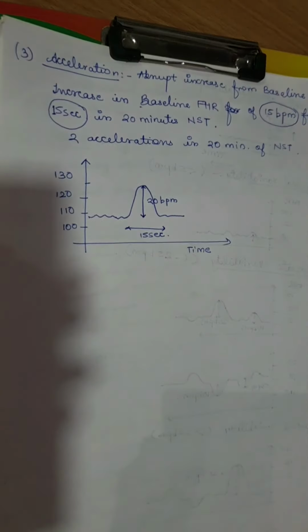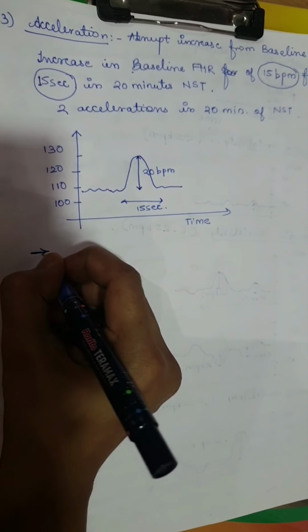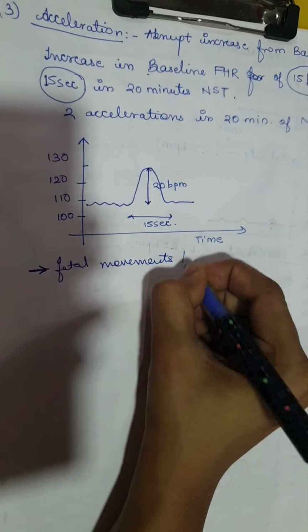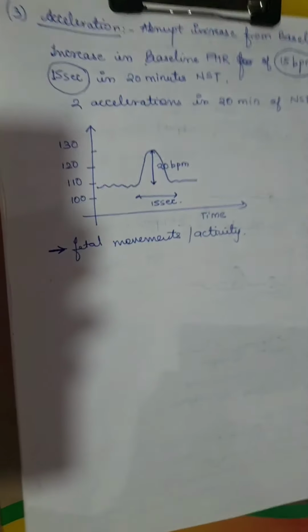Now, why do these accelerations occur? These accelerations occur due to the fetal movements. The fetal movements or activities going on intrauterine result in this acceleration.